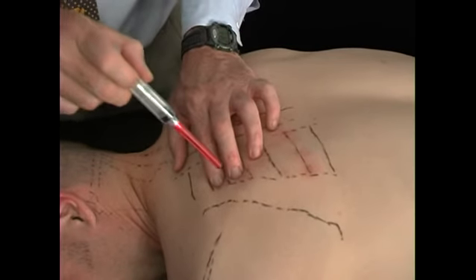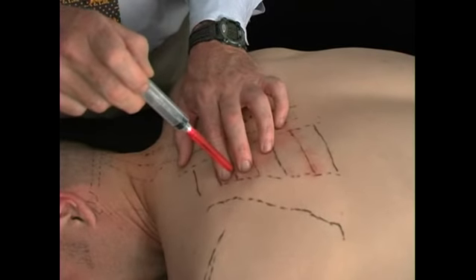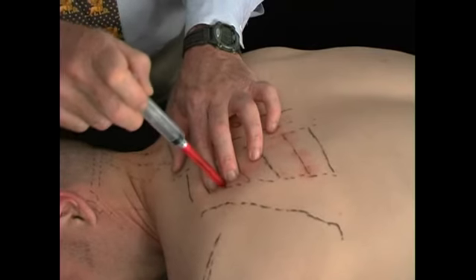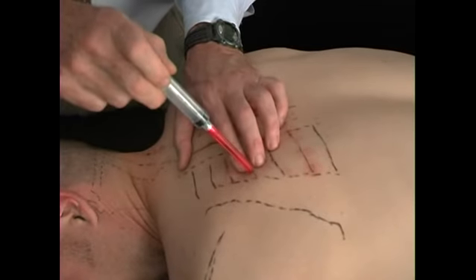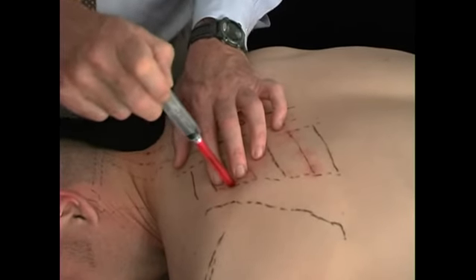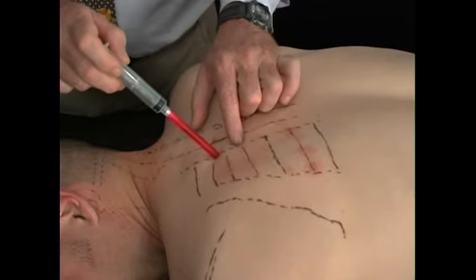Again, a lot of skin compression coming down to that depth. If I don't hit it at that same depth that I hit it here, then I'll come back out to the skin level and I'll move down 1 millimeter or 2 and go back into that level. If I don't hit it there, I'll come back up. There's my midline, come up 1 millimeter or 2 from midline and try it again. That way you're experimenting at that same safe depth where you know you've hit this rib and moving the syringe up and down. And ultimately then you'll find that rib, and then you can follow your line across again to the midline of the costotransverse process.